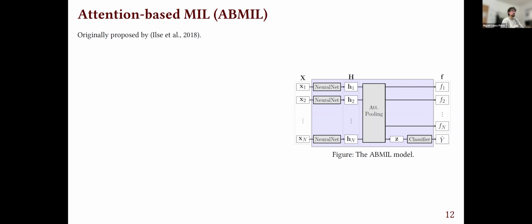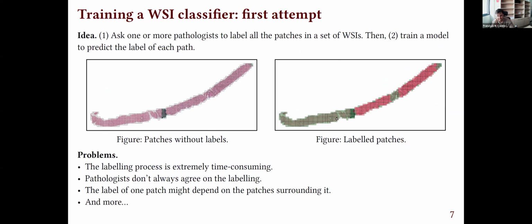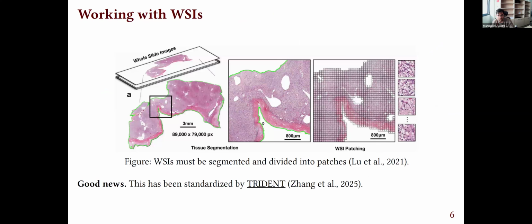Okay, there are two more questions here in the Q&A. One from Abbar Shafiq. I would like to know if the fatty tissue are in majority in the bag, does that influence the inference? Because fatty tissue is mostly white background. I think you mean the white background here is removed in this patching process, so it doesn't influence the prediction.